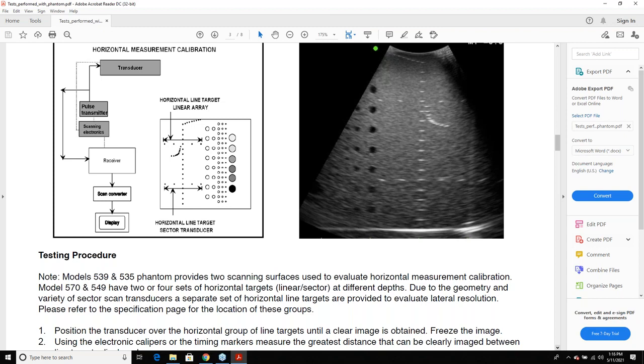You can see your resolution array goes this way while this one goes this way. So the measurement that they're describing here is these right here, but it's backwards. And again, as I said, I would never do these 2. I'd leave it at these 2 because they're 2 centimeters defined.